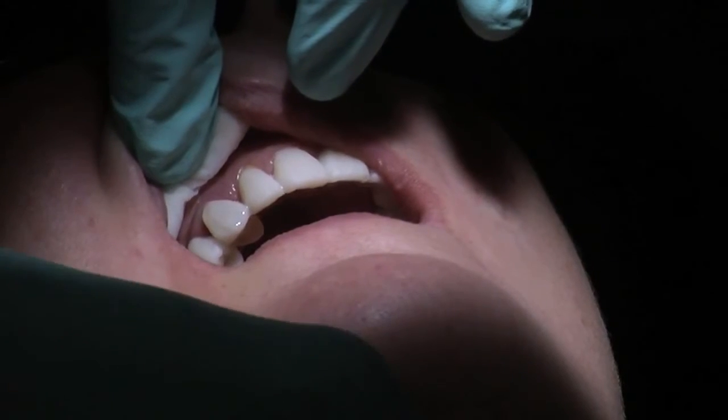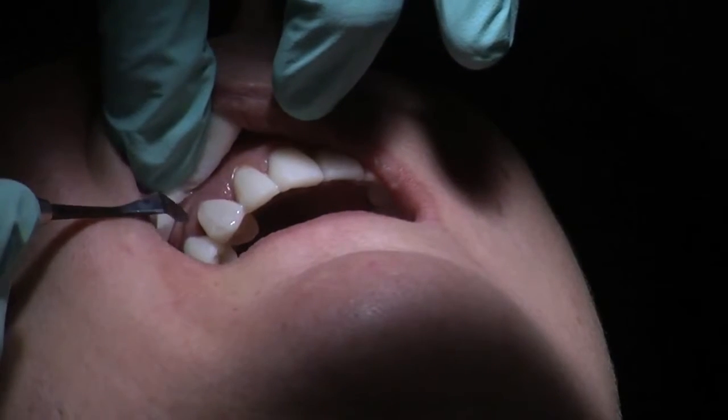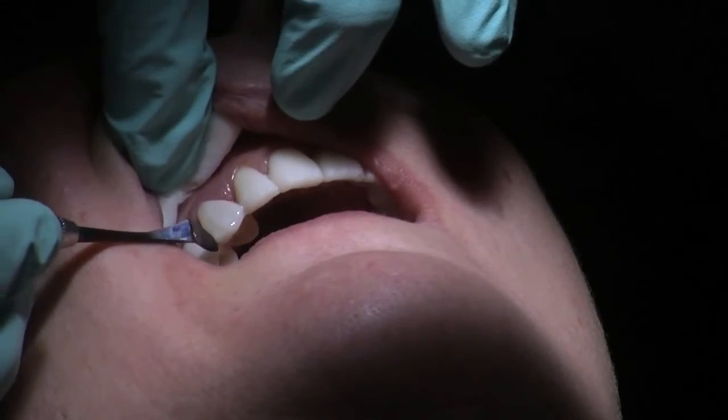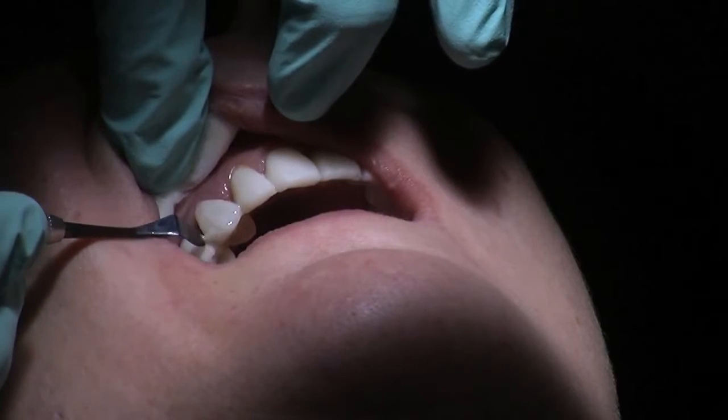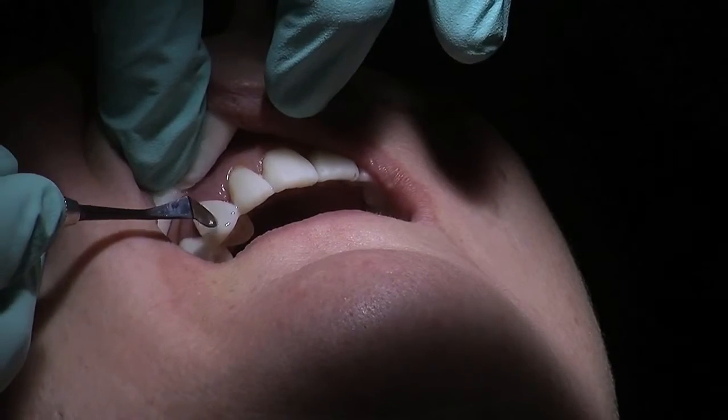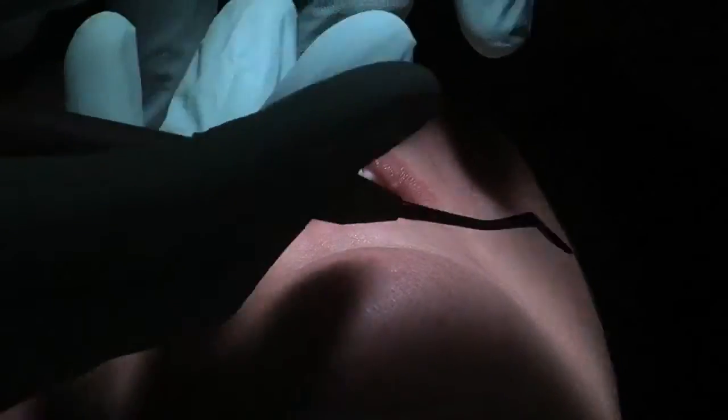And then this instrument here, the spade, is fantastic. It just very gently manipulating the material into the right position. I like to get as much work done as I can just by playing with the material rather than drilling later. Have the light please.